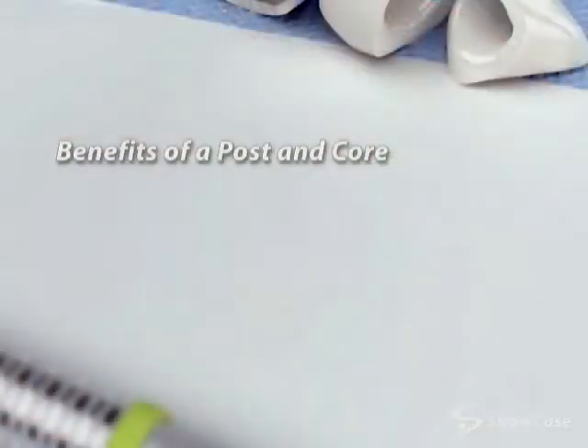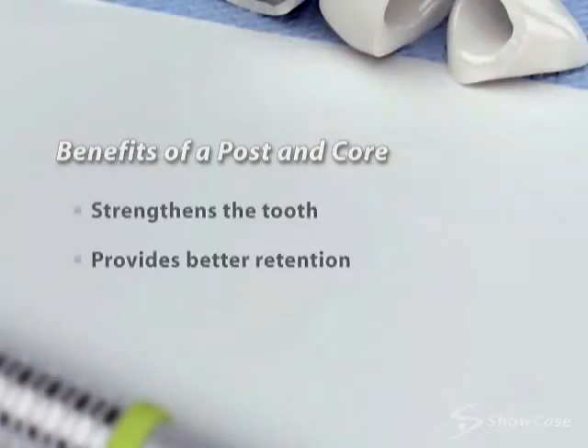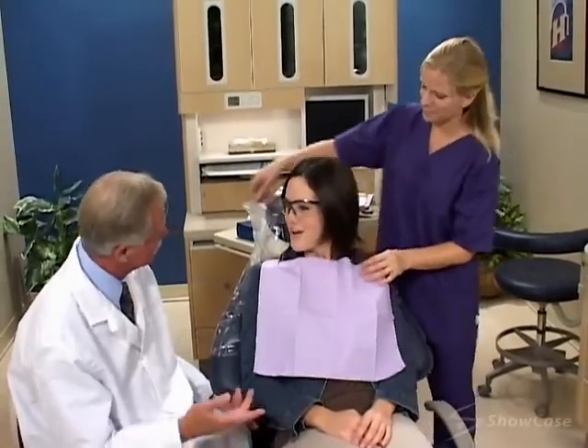Placing a post and core in a tooth prior to a crown strengthens the tooth and provides better retention for the crown. A post and core is an important step for saving teeth that may have been damaged by fracture or decay.